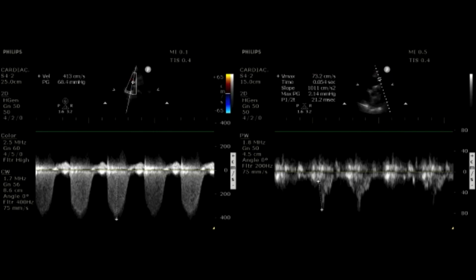But apart from that, just the D-shaped septum by itself is not a useful indicator of acute versus chronic right ventricular dysfunction and overload. I hope that answered it.